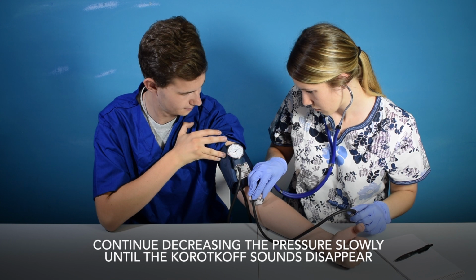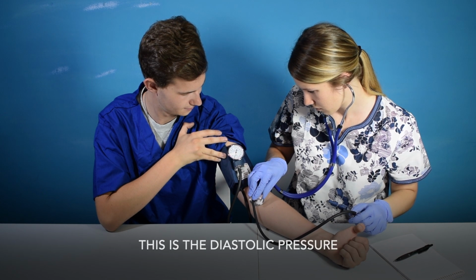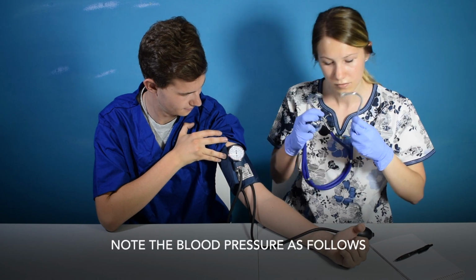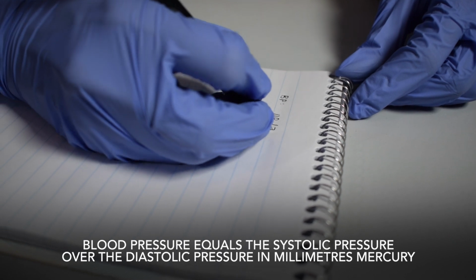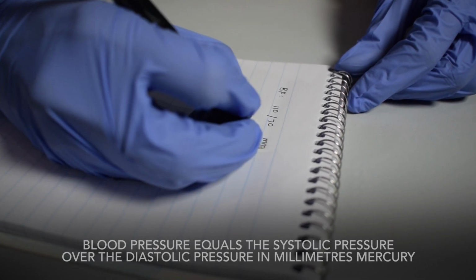Continue decreasing the pressure slowly until the Korotkoff sounds disappear. This is the diastolic pressure. Note the blood pressure as follows. Blood pressure equals the systolic pressure over the diastolic pressure in millimeters mercury.